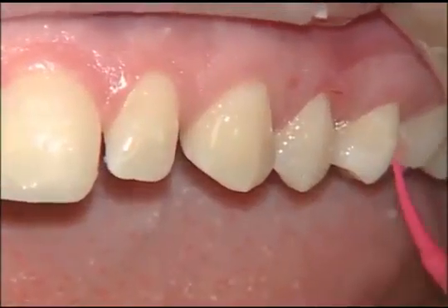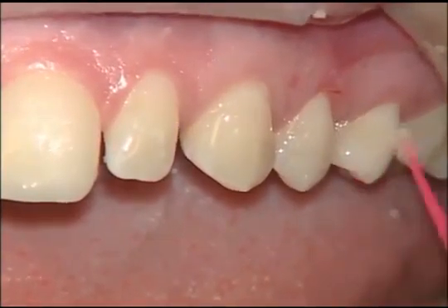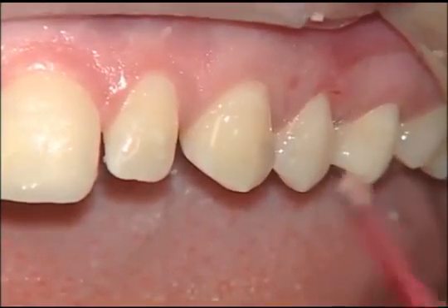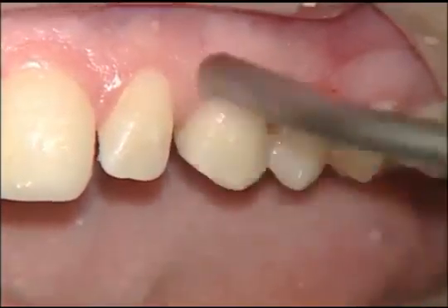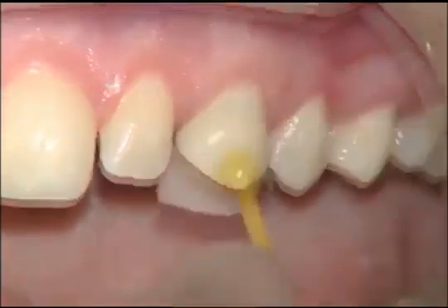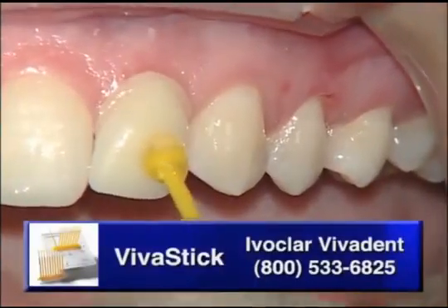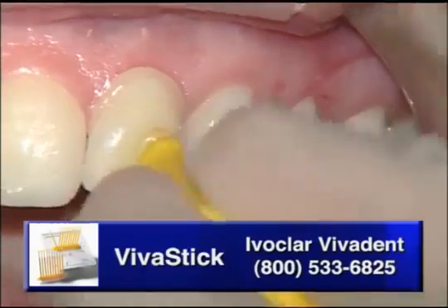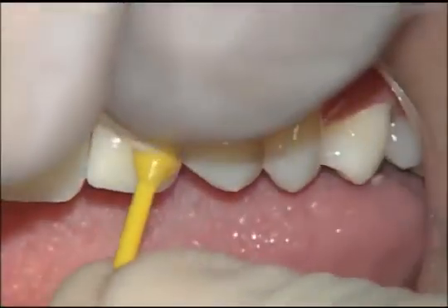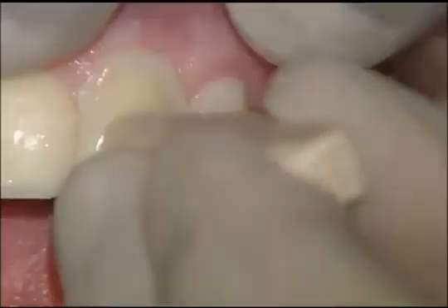Once again, we're applying the adhesive from the Scotch Bond Multi-Purpose Plus system to the etched enamel surface. As you dry that etched enamel surface, you will notice the frosty appearance that we're used to seeing. And we're going to air thin the adhesive as well. Here we're using a Viva stick from Ivoclar Vivadent to place some of the smaller veneers, and it sticks extremely well to small restorations like veneers or inlays and things like that. In fact, you have to hold the restoration down just to get the stick off.